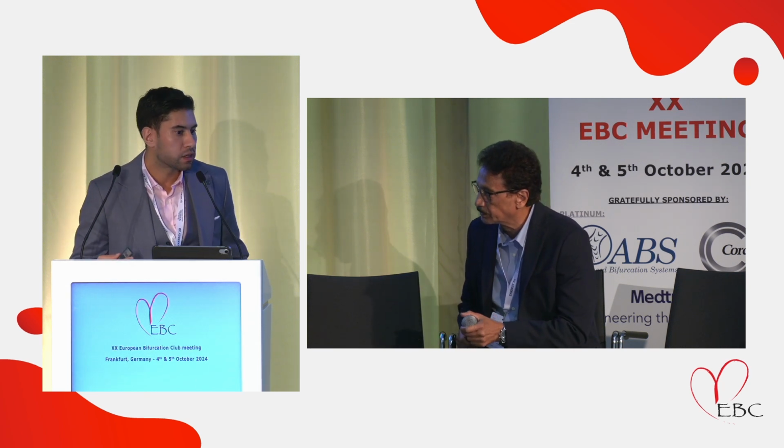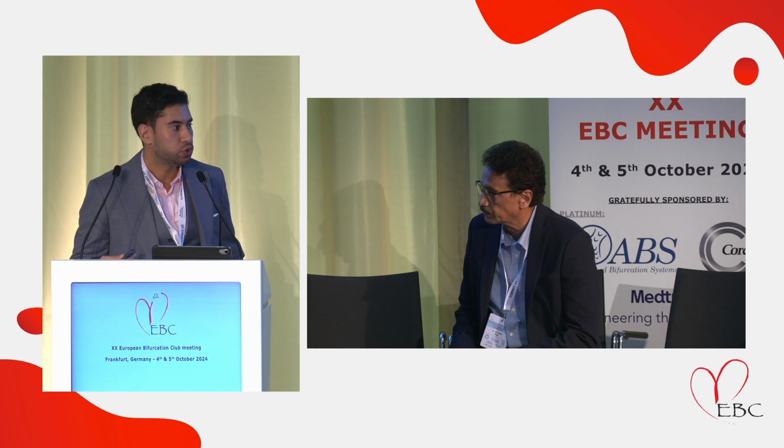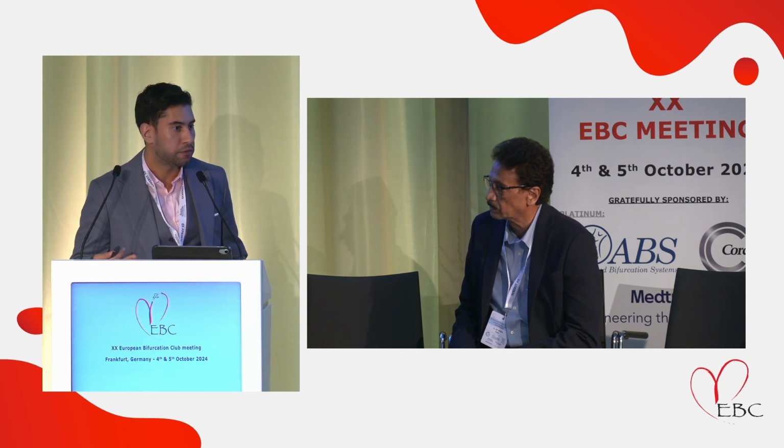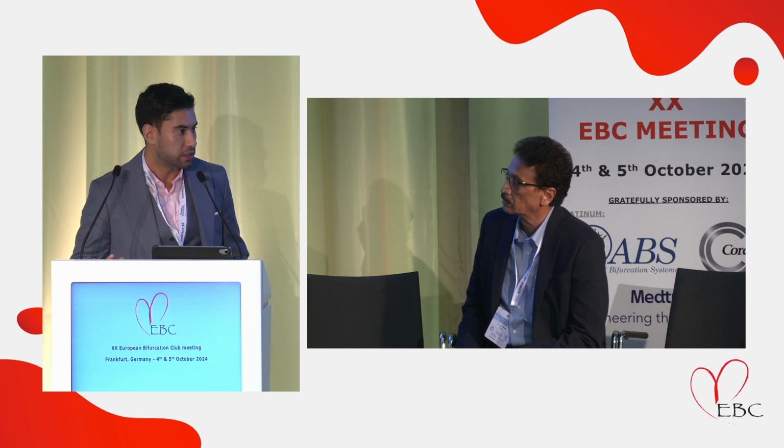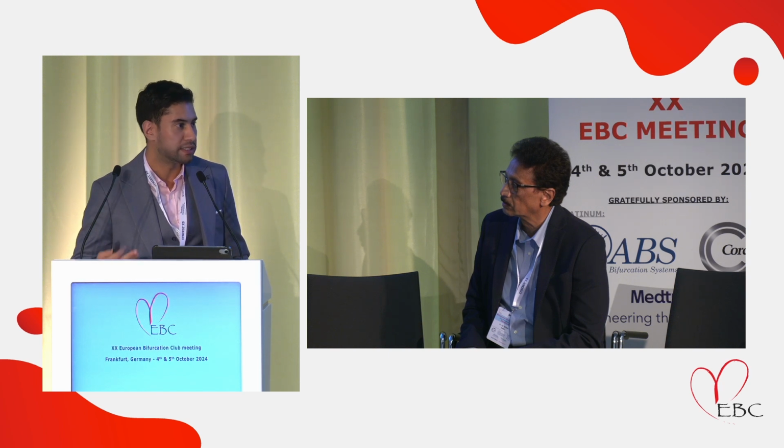In terms of lesion preparation, they should go through what we already know. If we need debulking devices, then we need to perform debulking before going on with the stenting technique. So debulking the calcium is a step before the stenting. The stenting should be only the last step after good lesion preparation, I would assume.